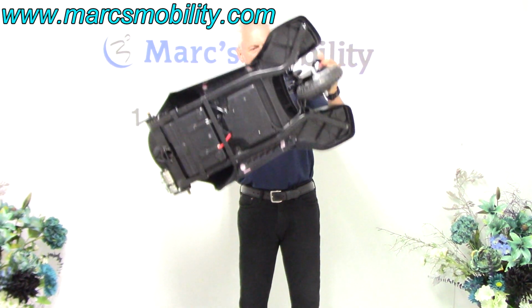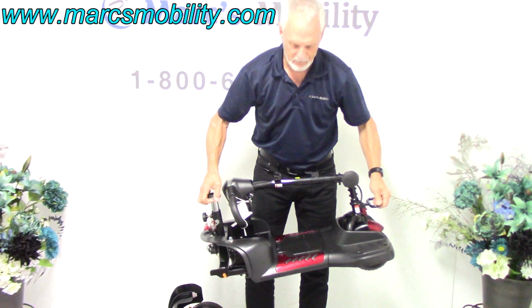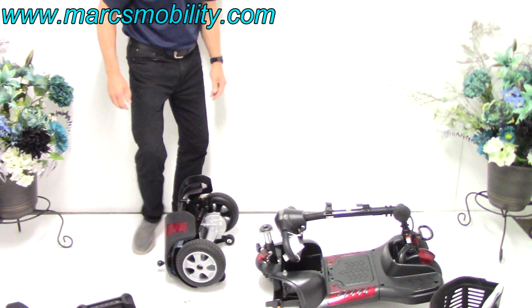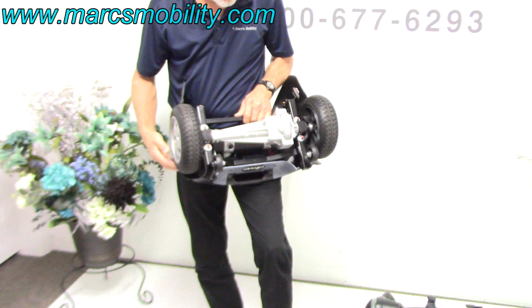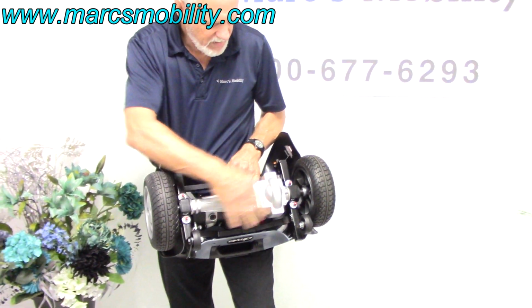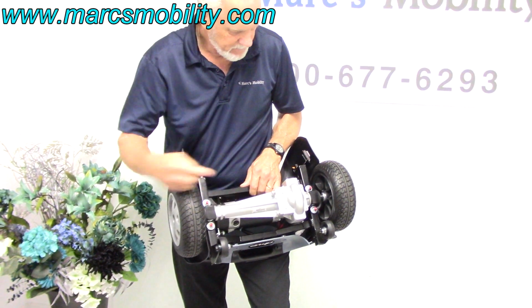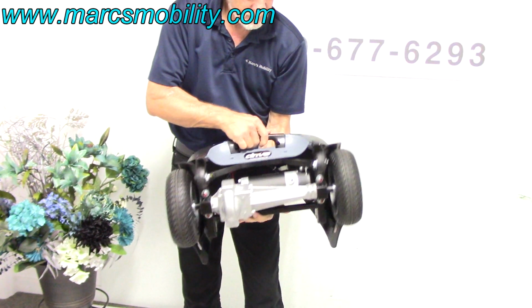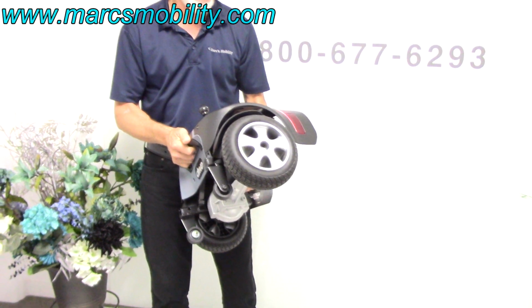This is the bottom of your scooter. This weighs about 30 pounds. This is your rear, right here. You can see your motor, you can see your transmission. It's a direct drive. It goes directly to the wheel. This is your back end, right here. And this part right here weighs about 35 pounds.